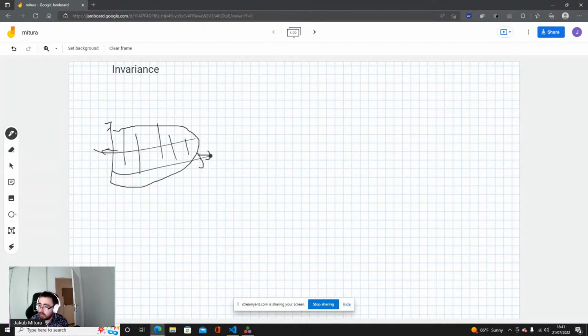So what kind of augmentation is used for CT images? Once more, it depends on the particular case, but usually the most important are spatial transformations, like translation and in some cases rotation. Although in many cases I do not use rotation because rotation can lose some information. If you imagine that something can change, and you can synthesize data that will look like this changed data, it's good to do.